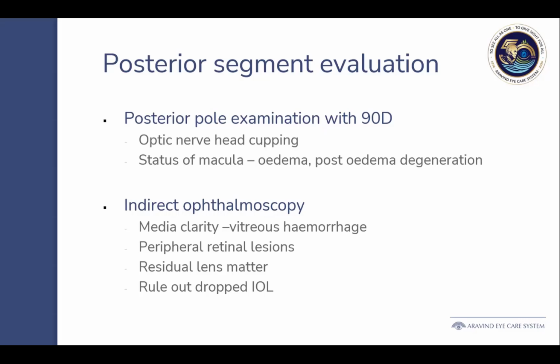Now, we had one case where we went ahead and put in an AC IOL too. Those were the days, about 10, 15 years back. And then this patient used to constantly come to us in the OPD. And he says, I'm all fine. But when I shake my head like this and look like this, and then he used to draw exactly the footplate of the Oroflex IOL. I see this image. So the only thing that we could tell him was, please don't do that. Okay. So always.